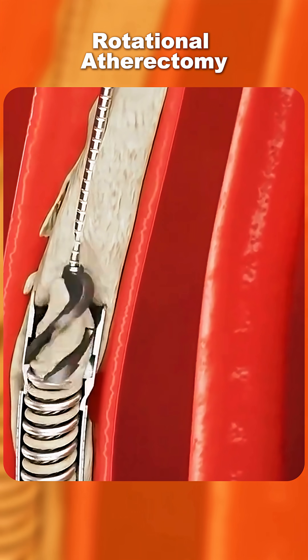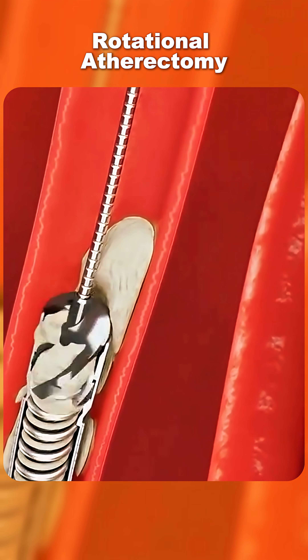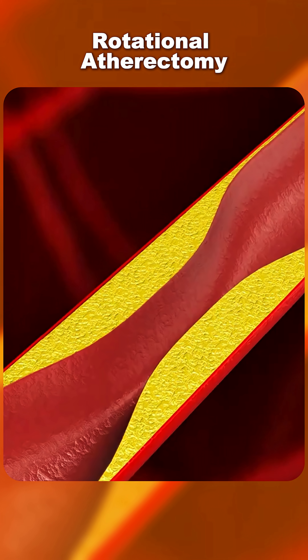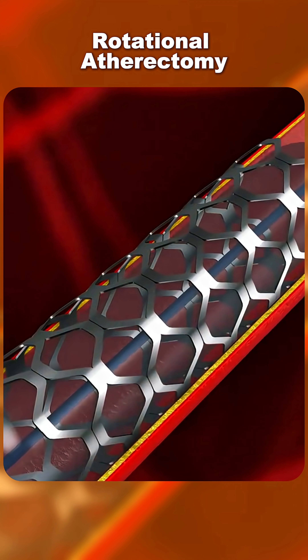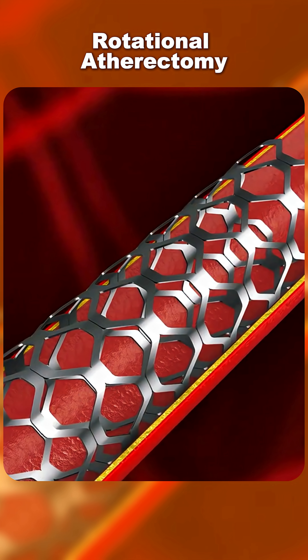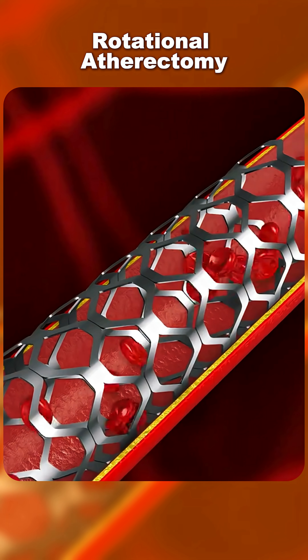By doing this, the plaque is smoothed down and the artery becomes more flexible. Once the calcified blockage is modified, the doctor can then insert a balloon or stent to fully open the artery and restore blood flow to the heart.